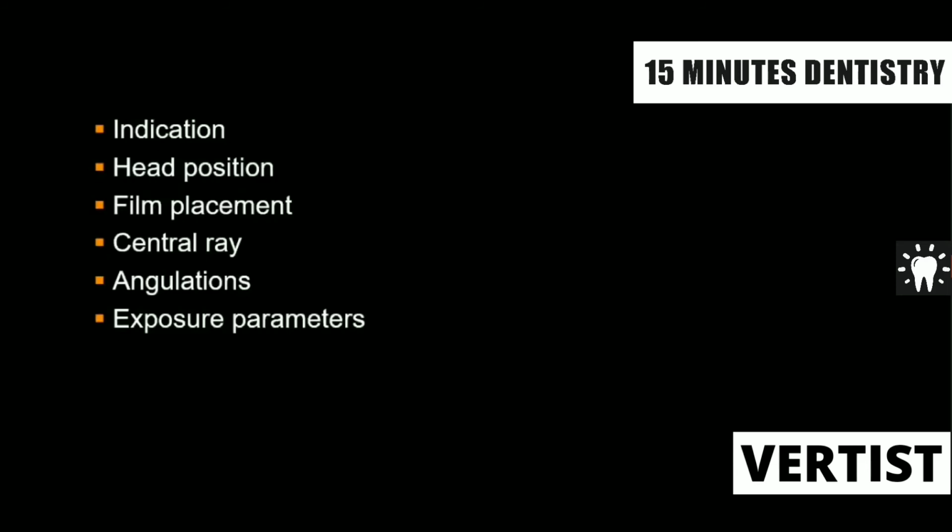That means which object, which part of the jawbone is seen in that particular extraoral radiograph, that will be our indication. That means if you want to see the body of the mandible, the angle of the mandible, the sinus, or the zygoma, whatever it is, that will be the indication. Clinically, once you find that the pathology is associated with the mandible, the sinus, or the symphysis, we should know which radiograph shows the symphysis, which is the radiograph for the maxillary sinus, and then we advise that radiograph. That is what we call the indication.